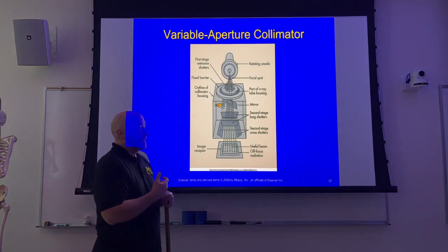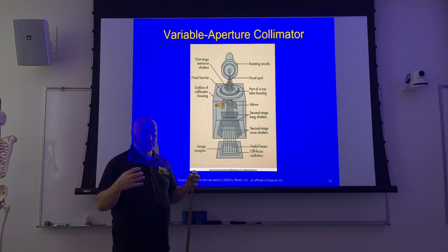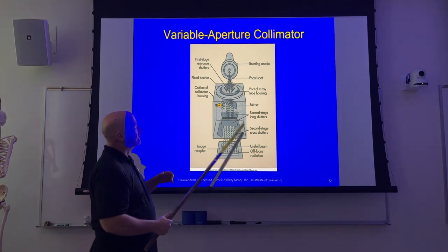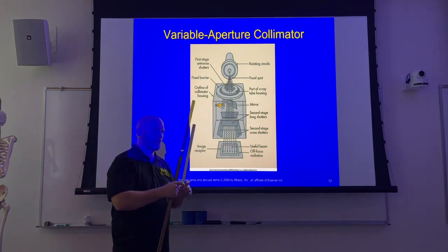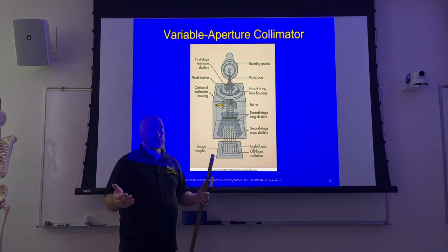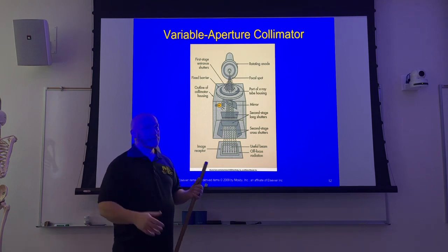So where it gets complicated is whenever we start talking about blooming. With blooming, we get an oversized electron field, right? So it's blooming of the space charge. The space charge gets too big, so that whenever we send them across the tube, the stream of electrons might hit somewhere aside from the focal track. So technically it's off-focus radiation. It is. But we're not going to call it that. Blooming that leads to off-focus radiation, we're just going to say is lost sharpness of recorded detail because of blooming. Even though it hits somewhere besides the focal track, we're not going to call that off-focus radiation.